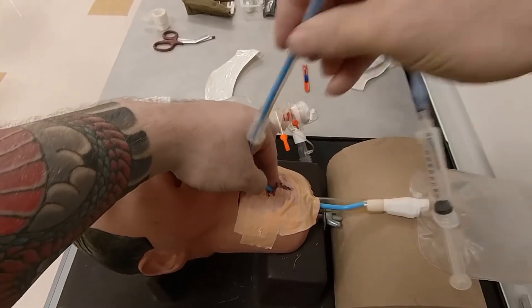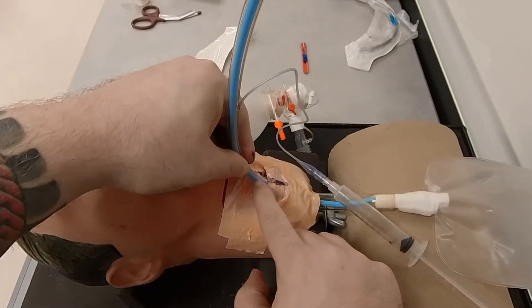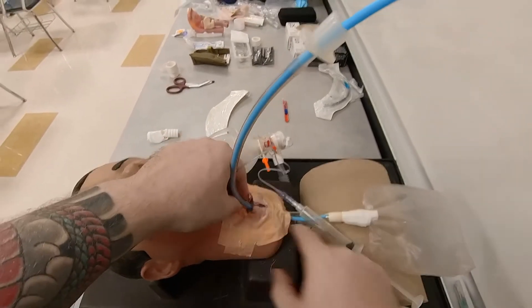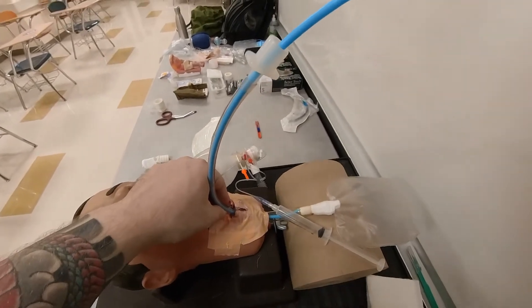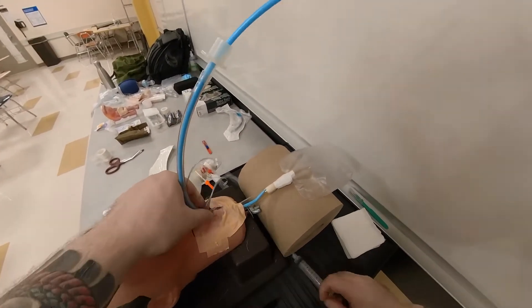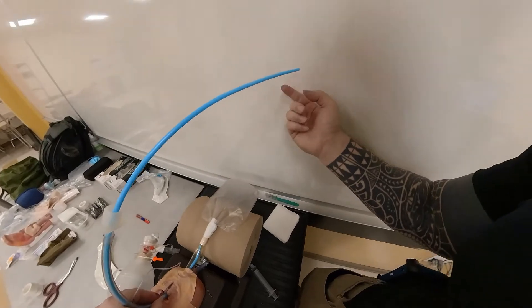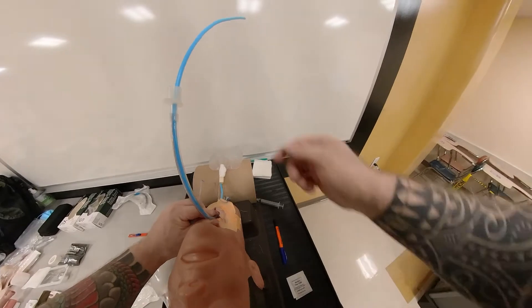Go ahead and introduce your 6.0 tube. You want to just bury the cuff past your incision marker. If you go too deep, you're going to right-mainstem the patient — you'll put this tube into the right mainstem bronchus. So stop at the appropriate depth. Inflate the cuff. When removing the bougie, do it in a direction toward the patient's feet, and anchor the tube with your thumb and index finger.